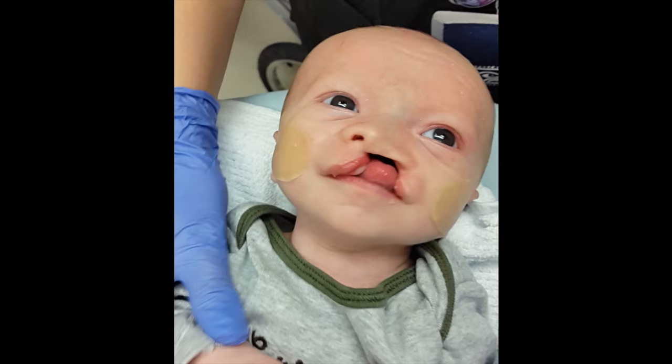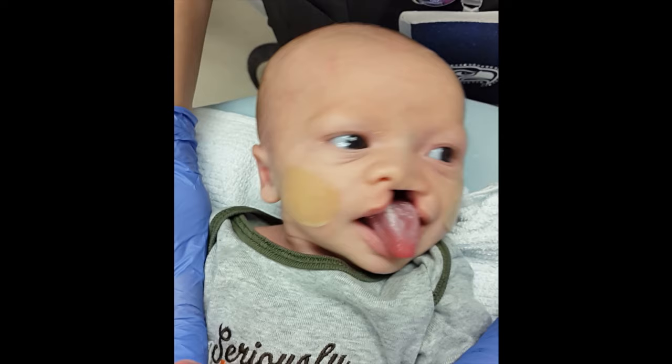Naso-alveolar molding, or NAM, is a treatment option for children born with a complete cleft lip and palate. At Seattle Children's Hospital, specialized orthodontists offer NAM therapy for infants with unilateral, bilateral, and mixed clefts.